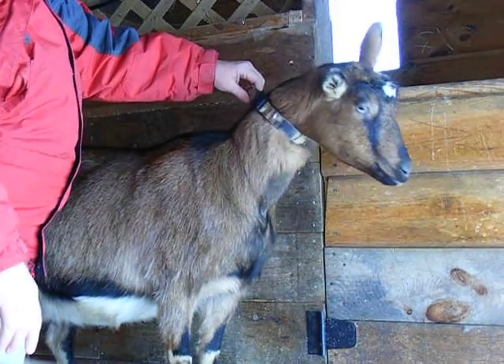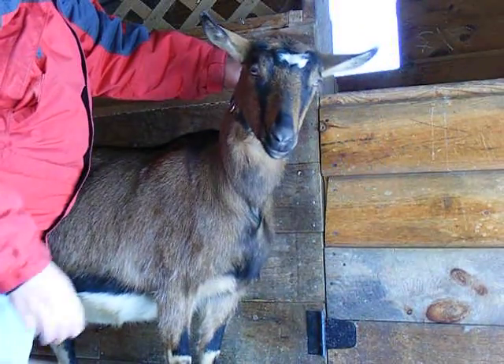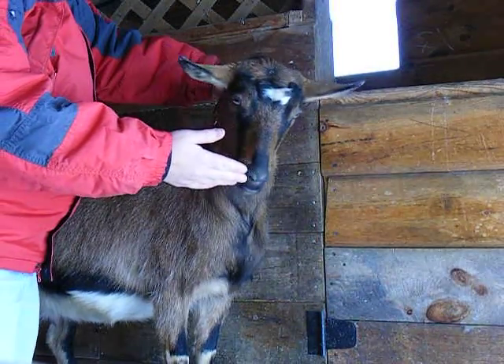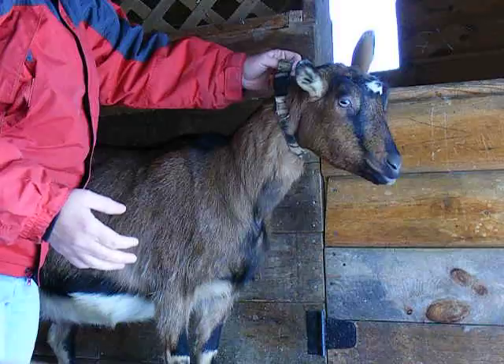We are getting ready to draw blood on Daffodil. She is 30 days past being bred to Jackson. We wanted to show you how it was done. Mallory is going to come hold her collar.